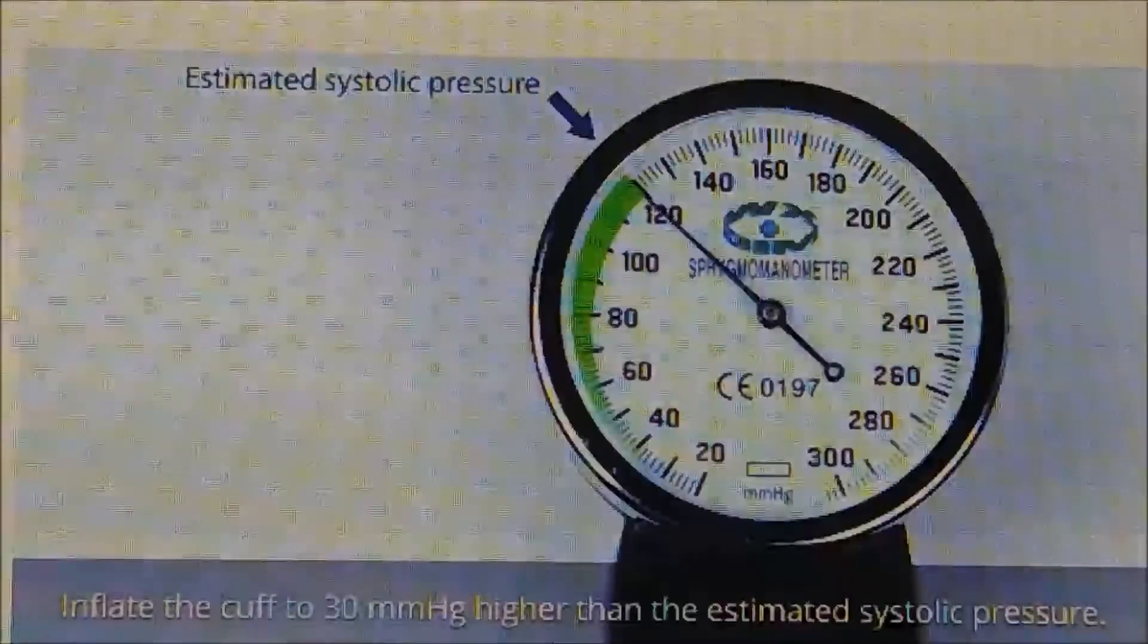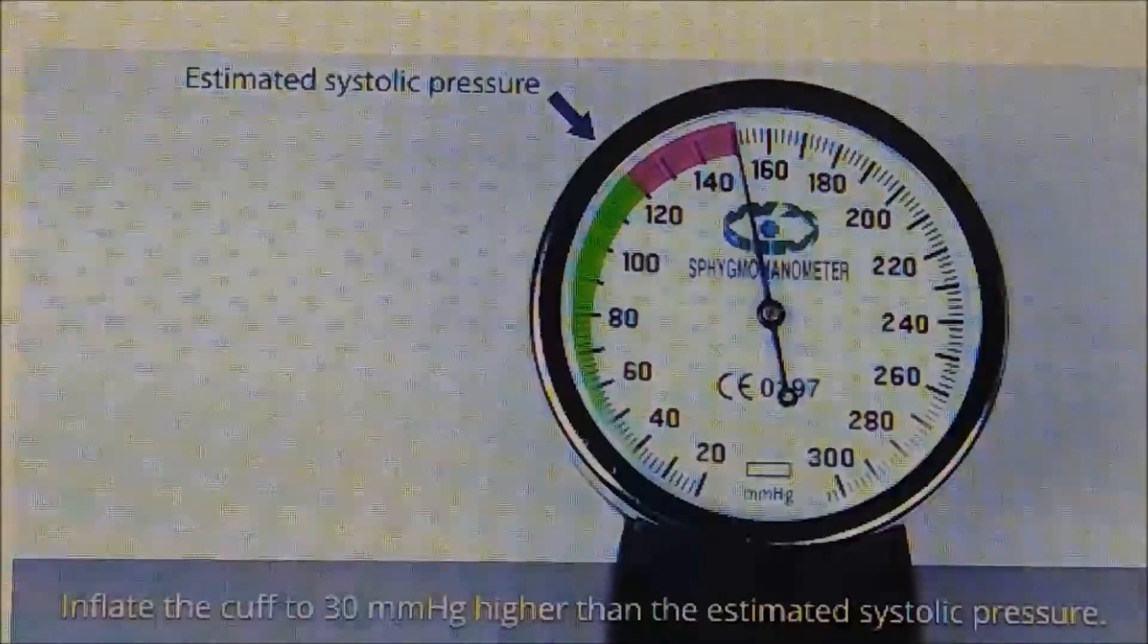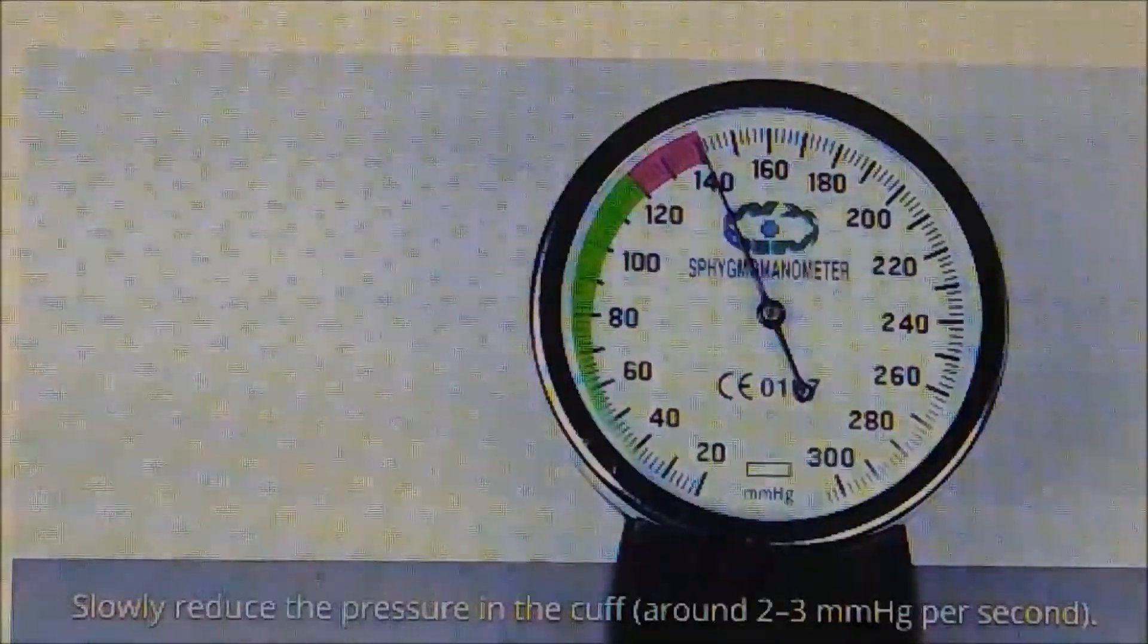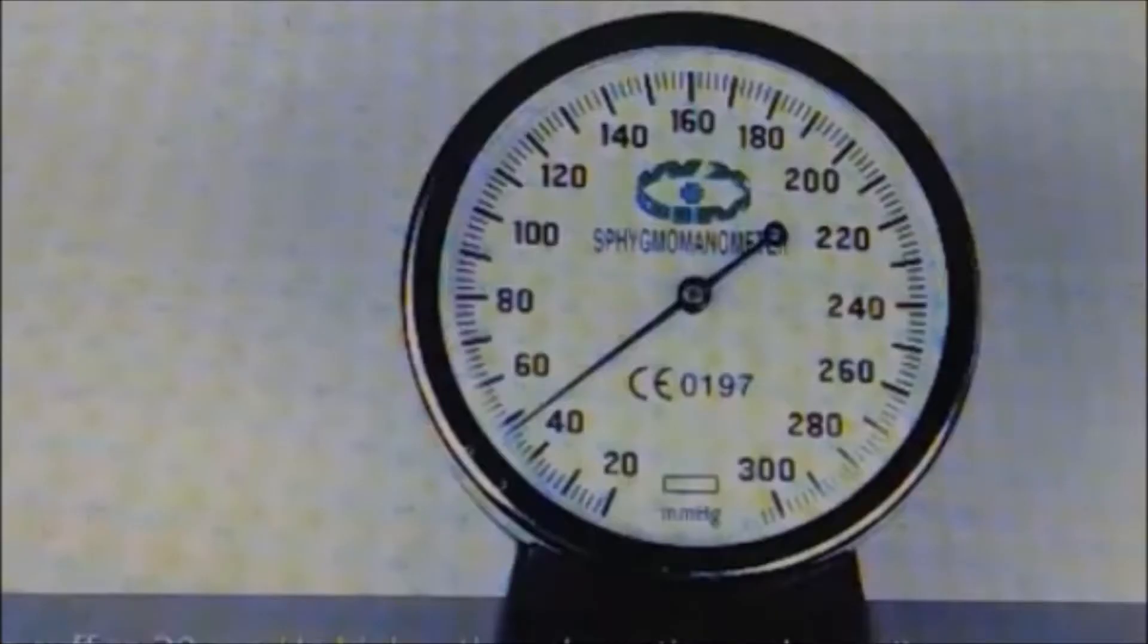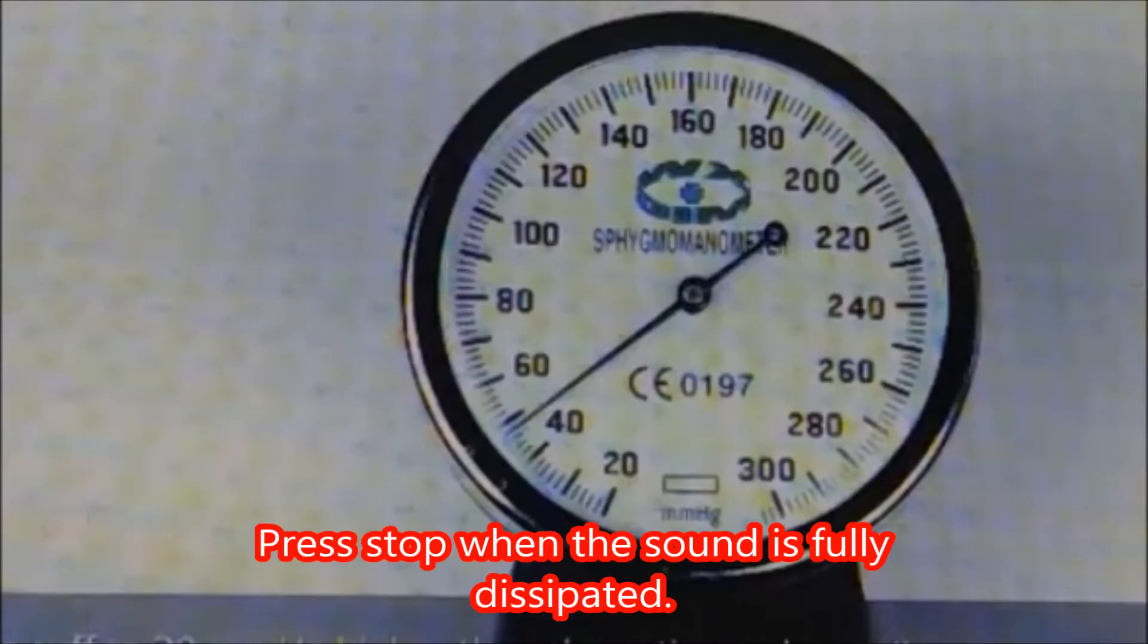Press start and inflate the cuff to 30 millimeters higher than the estimated systolic pressure. Now slowly reduce the pressure in the cuff. Wait for the sounds of Korotkoff to be picked up by the cardio microphone. Press stop when the sound is fully dissipated.